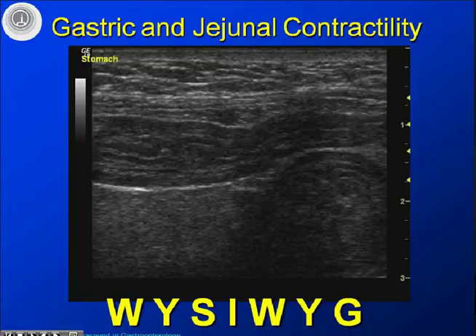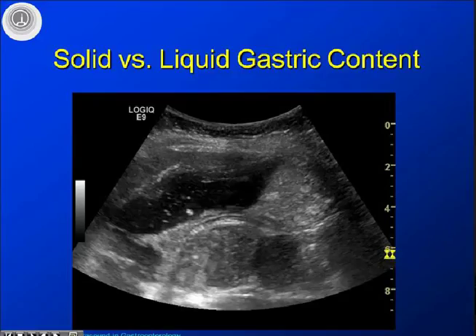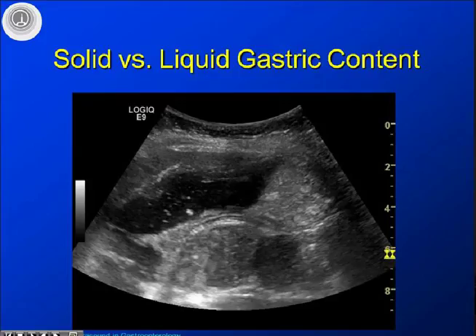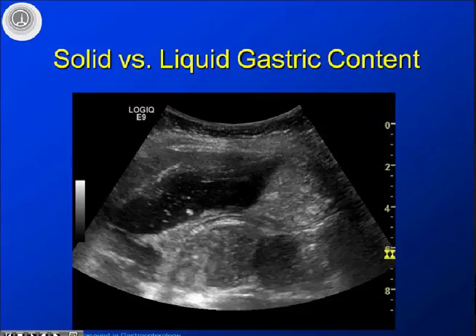The beautiful thing about ultrasound is what you see is what you get — seeing is believing. In this case you see the stomach volume with a solid meal lying here and a liquid meal on top. On this video you can appreciate how the solid meal is decanted and moved towards the distal part of the stomach, and you can also observe the small intestine below. So you can use ultrasound to study how the meal is dealt with in the stomach.